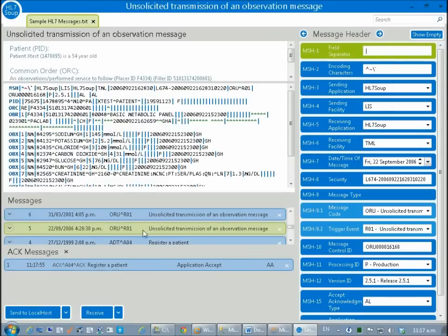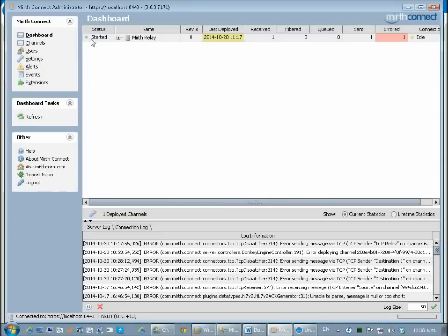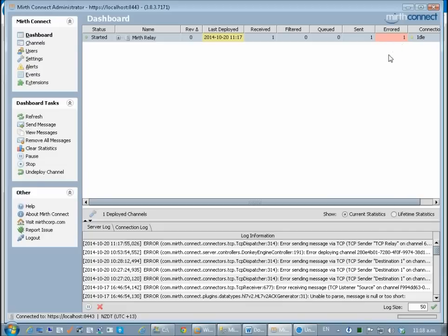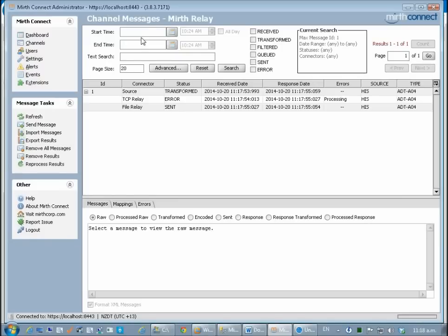As we can see the message has gone through, received and accepted that. Now of course that should have failed. If we go back to Mirth and I have a look at its dashboard I have an error message here. The reason that's going to have failed is because HL7Soup was not yet configured to receive that message. I double clicked on that so I can now see that the TCP relay error but the file relay actually sent. So that one succeeded.